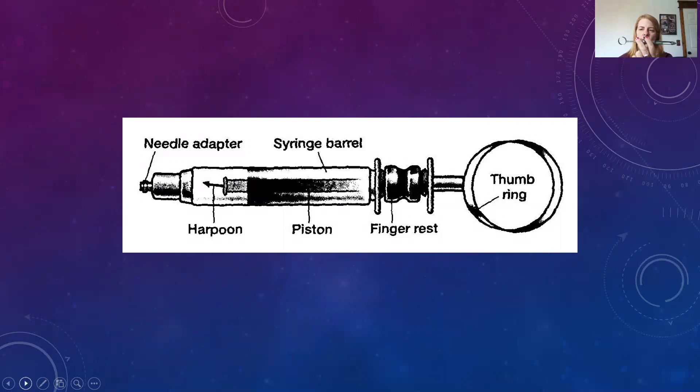We want to make sure that we have the thumb ring attached well. It twists on and off, so we want to make sure that it is on so that we don't get into an injection area, go to aspirate, and then have it come off — then we would have to take everything out and start over. The hub and syringe adapter can have a plastic or metal hub that twists on, and our harpoon goes into the rubber stopper.